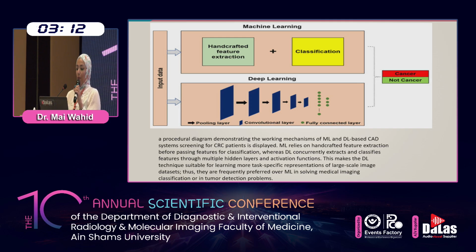So what can the model do? It can do tumor segmentation, outlining the tumor automatically; staging support, predicting the T stage or lymph node involvement; treatment response, assessing how well the tumor is responding to chemoradiotherapy; and surgical planning too, identifying the MRF involvement. So all these tools can speed up workflows, reduce human error, and ensure consistent high-quality interpretations. But these models, however, still need careful validation. They are not replacing radiologists. They are augmenting them, helping reduce fatigue and focus on more complex decision-making.